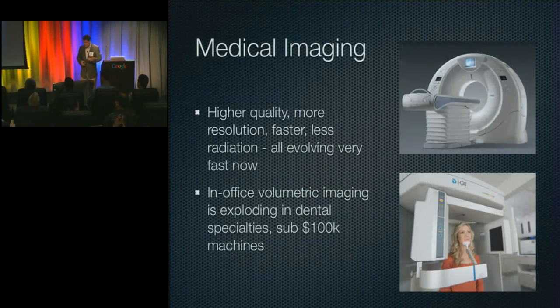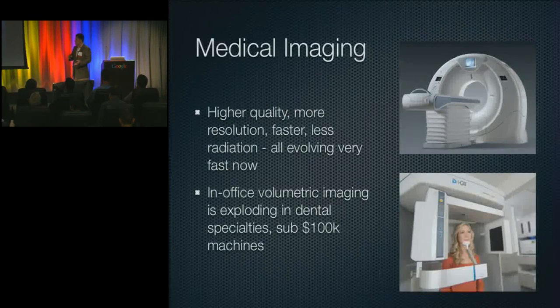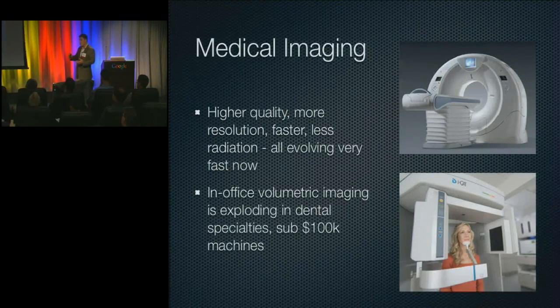Moving ahead to medical imaging, there's a lot of movement going on in medical imaging, and much of what you'd see in regular hospital-based imaging is everything moving to higher quality, better resolution, faster, cheaper, probably not. I mean, cheaper in some ways, but medical imaging actually turns out to be fairly costly. If you've had to go in to get your knee scanned with an MR, typically those procedures still cost a couple thousand dollars, which is very costly. So there is a push to try to make that cheaper. And in CT, the same way, there's been a push to reduce radiation, which has been a big part of it.